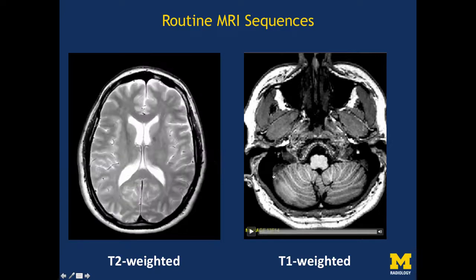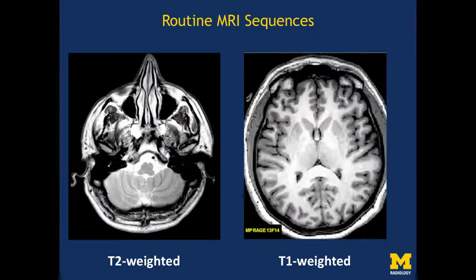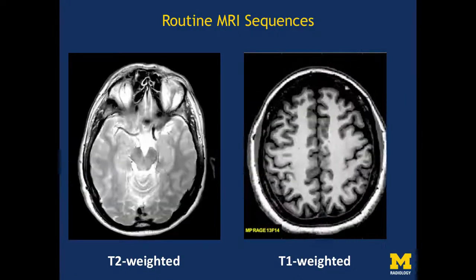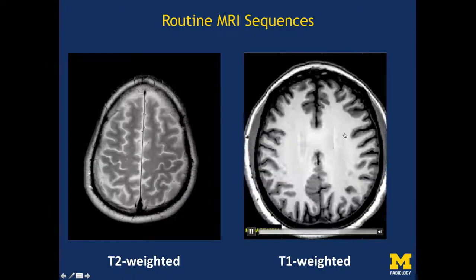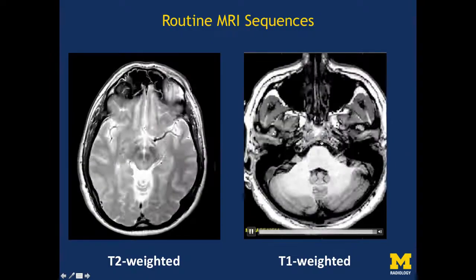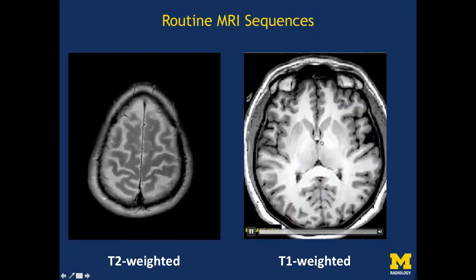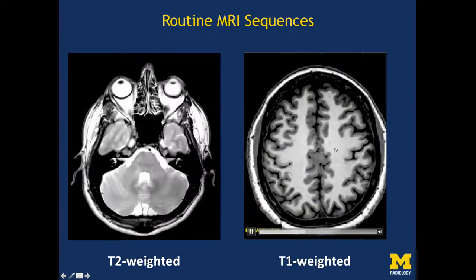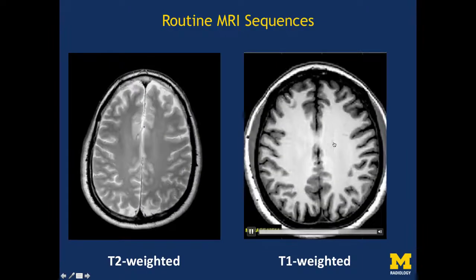With a different type of sequence, we say we need more spatial resolution. Moreover, we want a different type of contrast. Notice the high level of gray-white contrast as well as CSF contrast. So with now sub-millimeter resolution and thinner slices, we may do a multi-minute scan, like say 3 to 4 minutes, and generate this type of image.